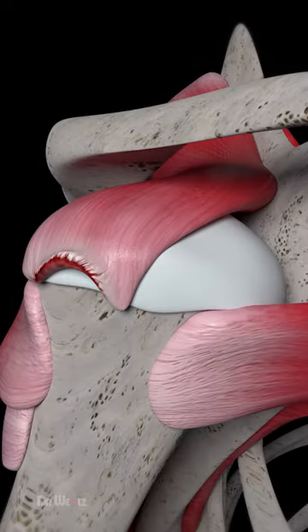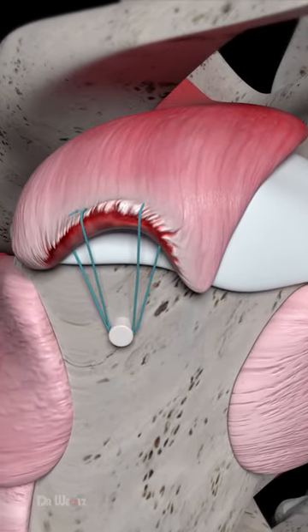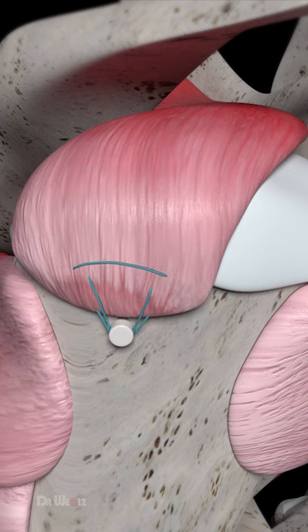Bone spurs are frequently removed arthroscopically to prevent the need to separate the deltoid muscle. The surgeon repairs the torn rotator cuff through the small incision made during the mini-open stage of the procedure.